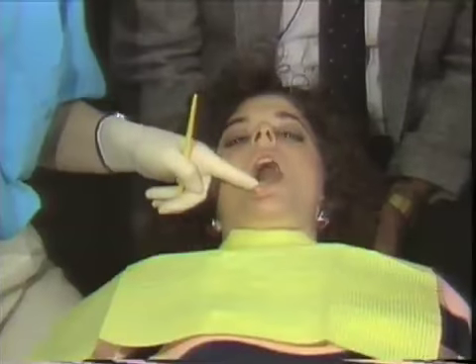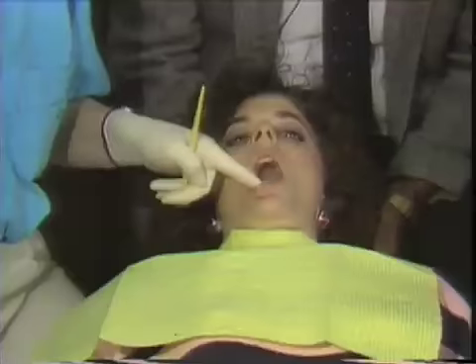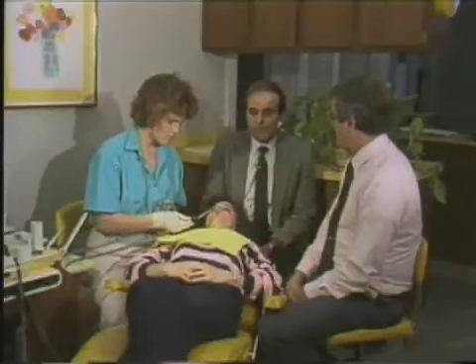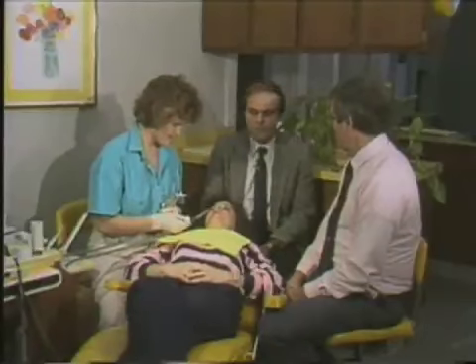Is there any advantage of using brush versus the cup? The brush would be used in that area where you felt that there may be a pellicle still present on the enamel surface. What's a pellicle? Pellicle is that clear coating that covers the enamel on a freshly erupted tooth. You'll find it most prevalent in bicuspids and some freshly erupted or newly erupted molars, posterior teeth.